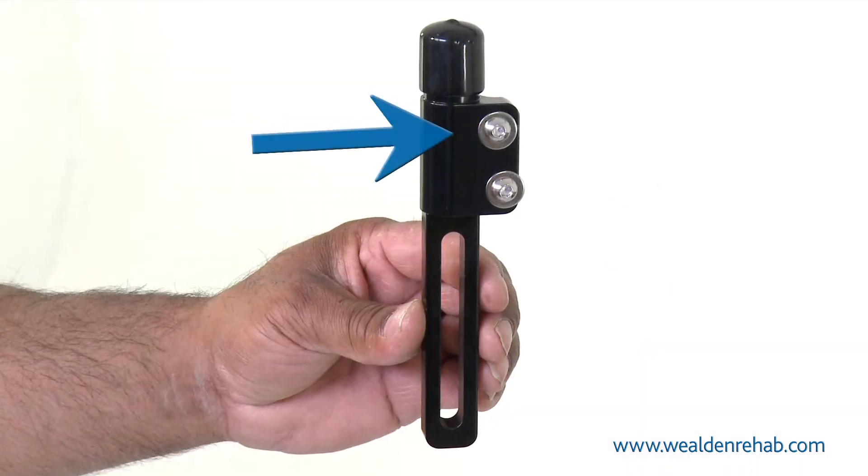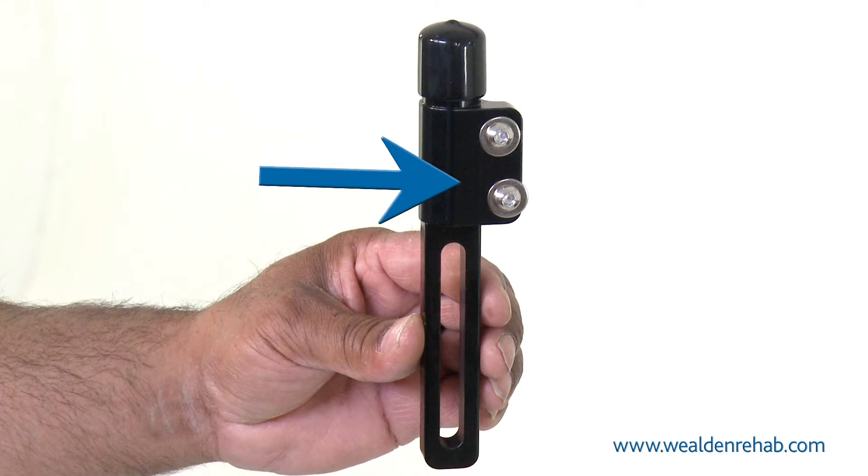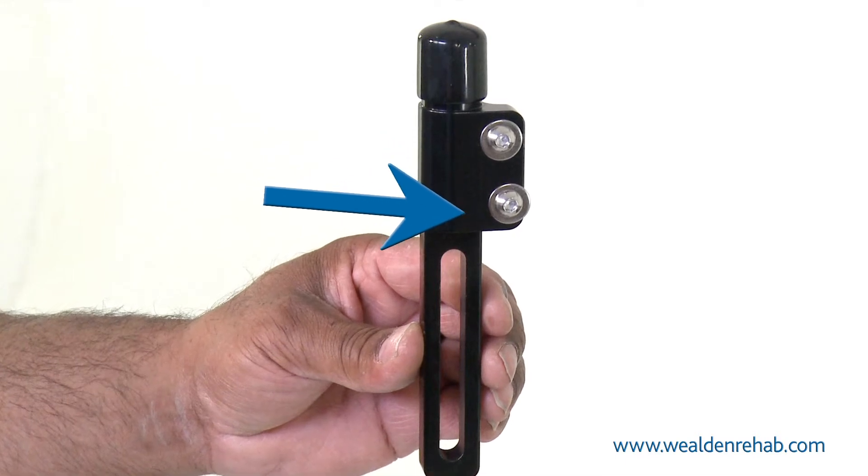Ensure the lateral mechanism is installed with the flat portion of the support fixing plate to the outside of the chair.